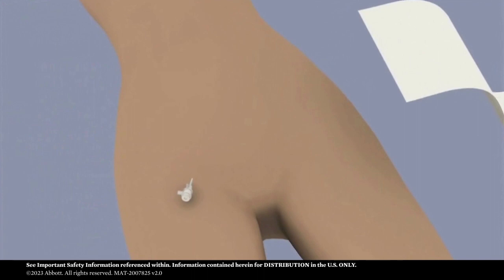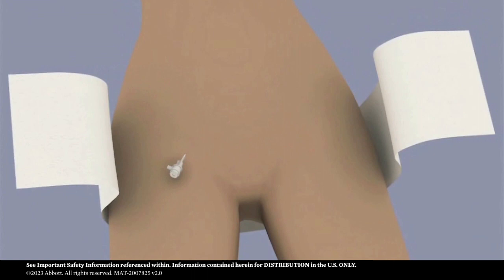Prior to sheath removal, place the belt under and around the patient's hips. Check that the belt is pulled up equally on both sides and has not become twisted or folded under the patient. The lower third of the belt should be in line with the sheath.